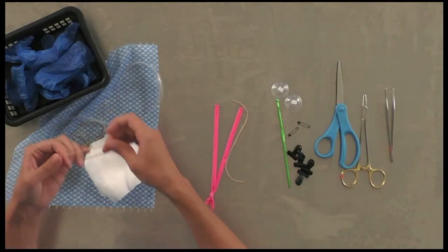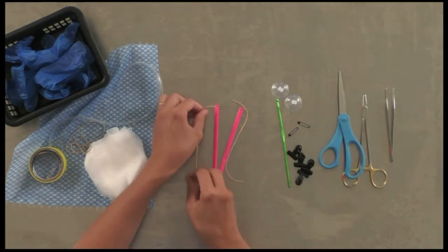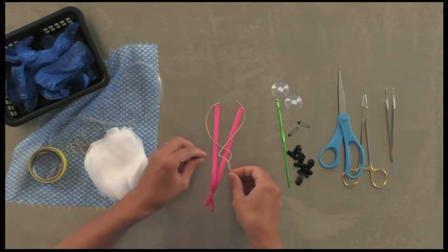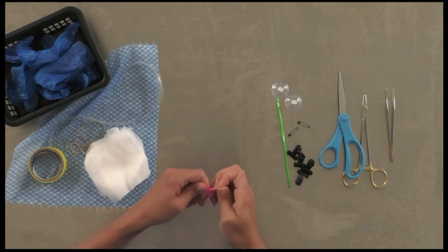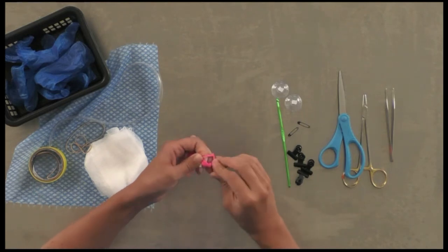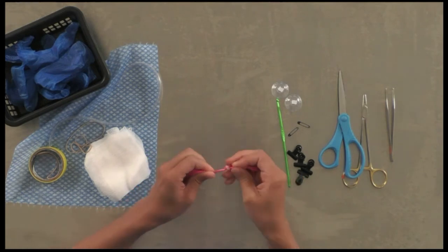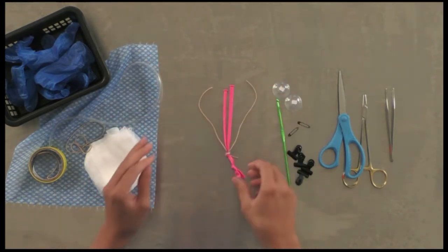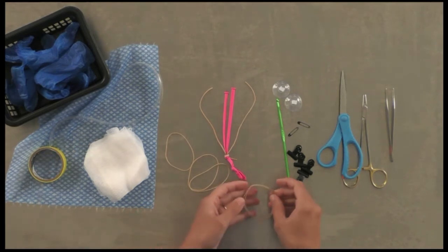Give it another rubber band snip, then take those two ends and line them up over your uterus and tie a knot incorporating those two bands — that will be your cervix. The two bands will be your uterine vessels.